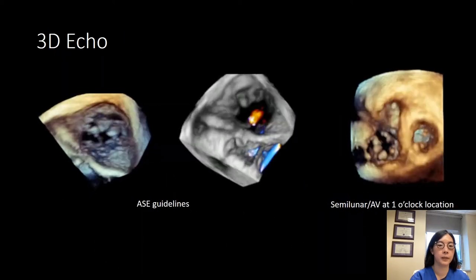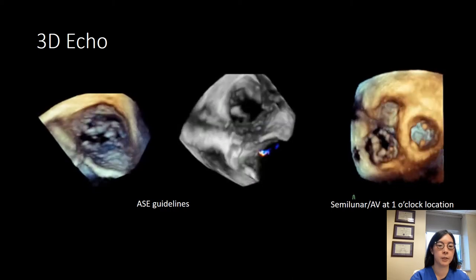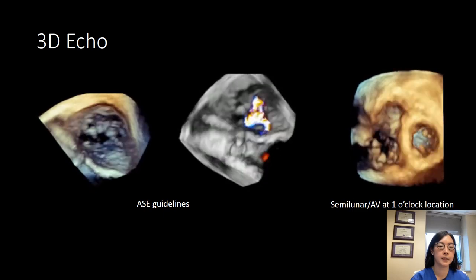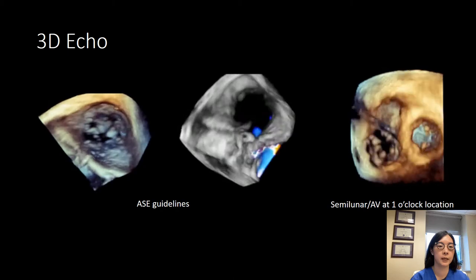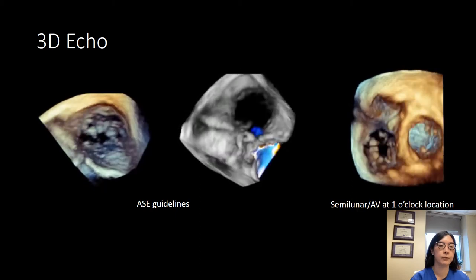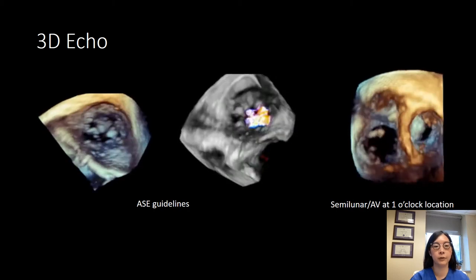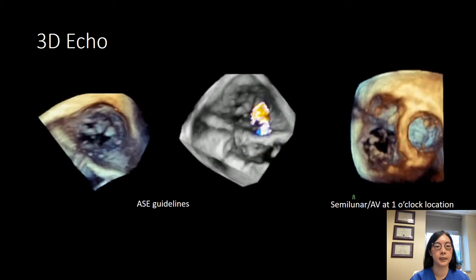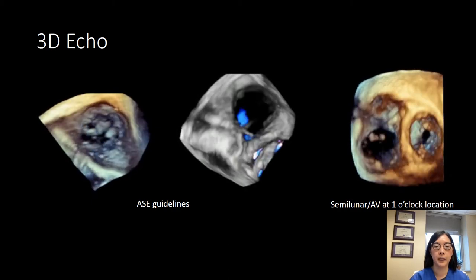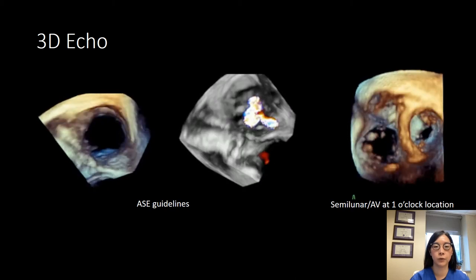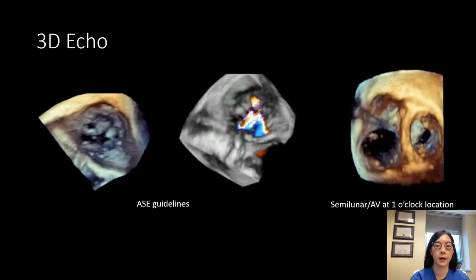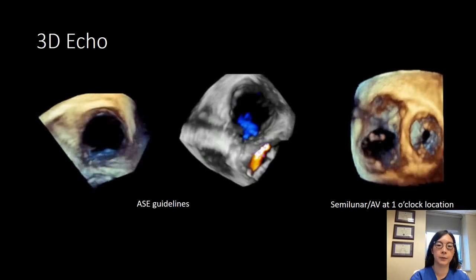3D echocardiography is very important for TriClip assessment, though more challenging than transthoracic imaging. The images are oriented per ASE guidelines with the septum at six o'clock. Viewing from the right ventricular perspective, the RV outflow tract is at about four o'clock, the anterior leaflet is at one o'clock, the posterior leaflet at nine o'clock, and the septal leaflet at six o'clock, with the color jet running up the septum. Many interventional echocardiographers prefer to reorient the tricuspid valve with the outflow tract at about one o'clock and the septum at about three o'clock for better procedural orientation.